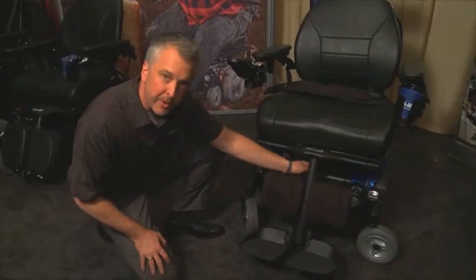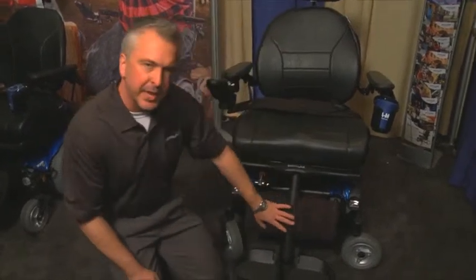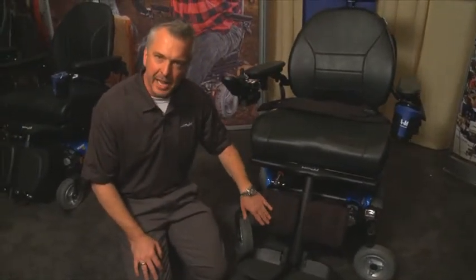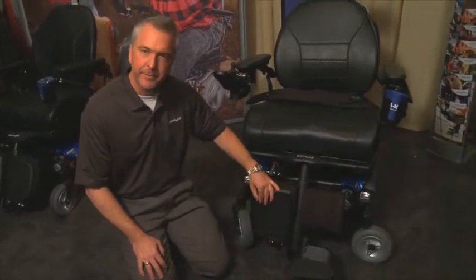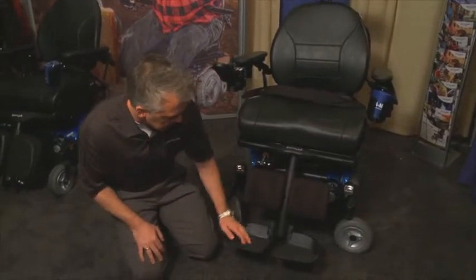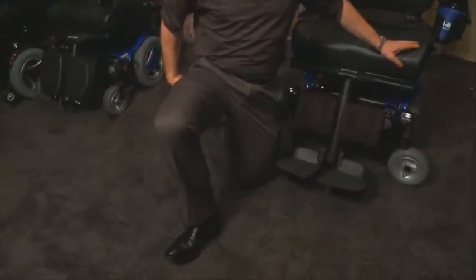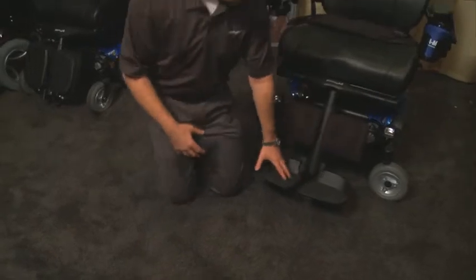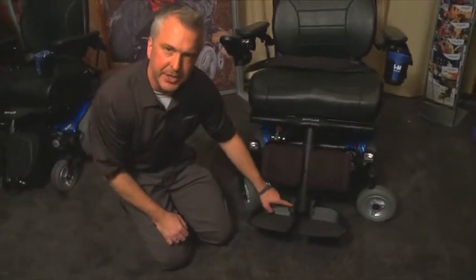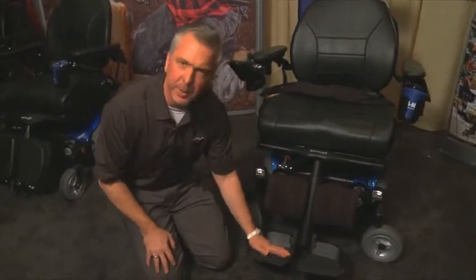We put a wider strap on the back of the leg assembly for added strength. We also changed the design of the calf pads — these are the curved calf pads. If you have the flat calf pads, the foot plates will actually flip up and fold flush so they won't be in the way when someone's transferring. For patients with larger legs who sit in external rotation at their hip, we have an adjustment feature where you can loosen a bolt and rotate the foot plates out to support someone accurately under the foot plates.